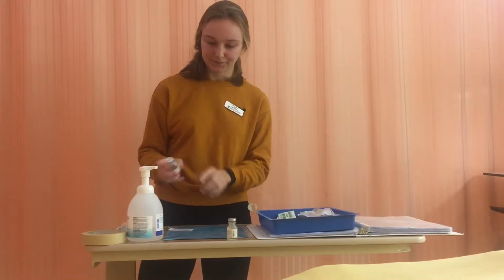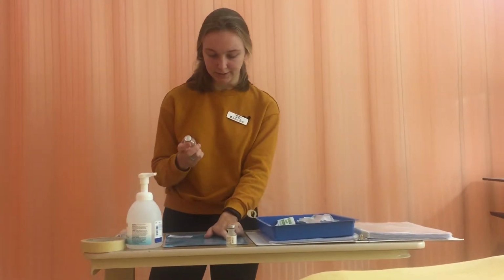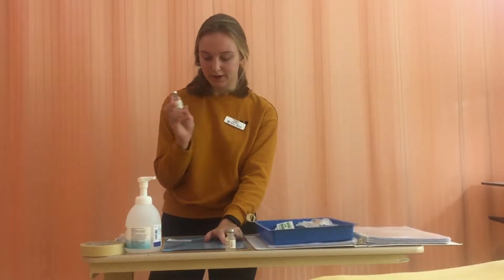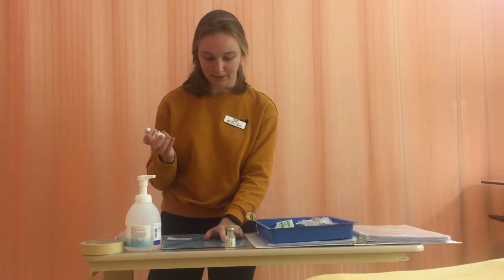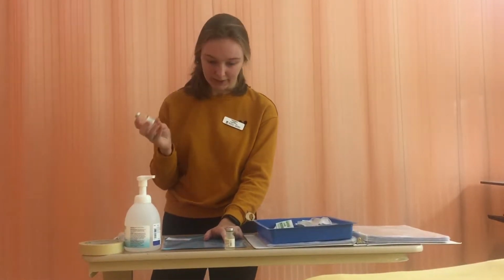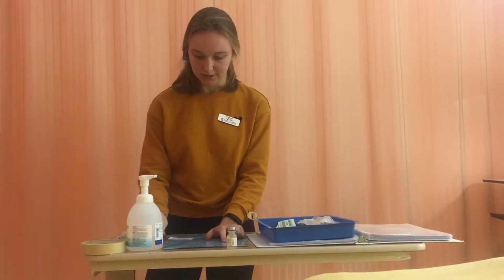So I have Emma Wrightson and no known allergies, so the right medication is Penicillin G. We need 3 million units and the vial has 5 million units, so we have the right amount. The route is IV, and it says it's an IV medication on the vial here, and the right time is now, and she hasn't gotten the medication yet, so we're good to give it.